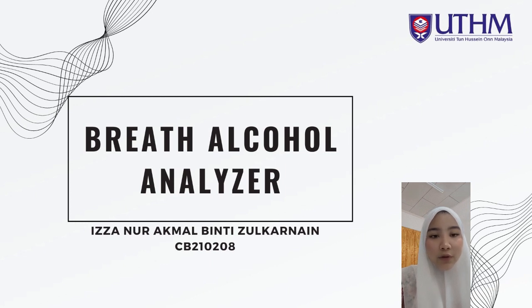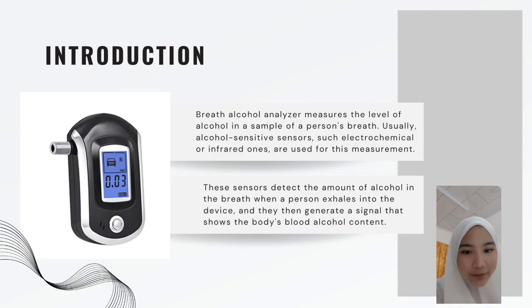CB210208. I'm gonna talk about breath alcohol analyzer. A breath alcohol analyzer, also known as a breathalyzer, is based on the idea that alcohol is absorbed into the circulation through the digestive system when a person eats it. A little amount of the alcohol is subsequently released into the breath through a process known as gas exchange as the blood carrying it circulates to the lung.